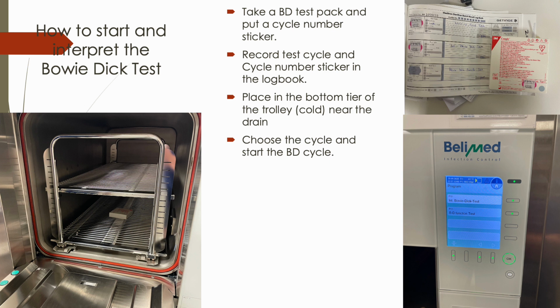This is where air is most likely to be trapped, creating hard to reach areas for steam. The test pack is designed to challenge steam's ability to penetrate these difficult areas, ensuring the steam is saturated and can adequately sterilize a load.